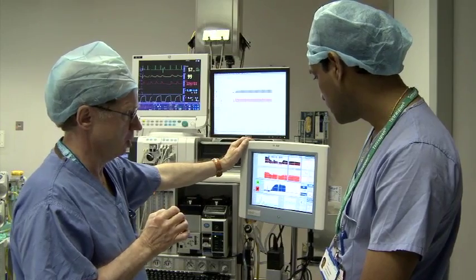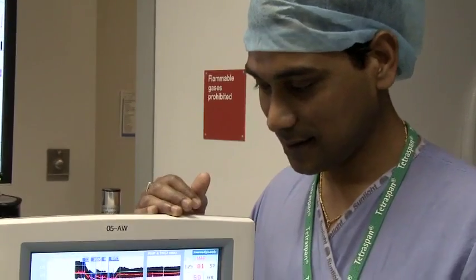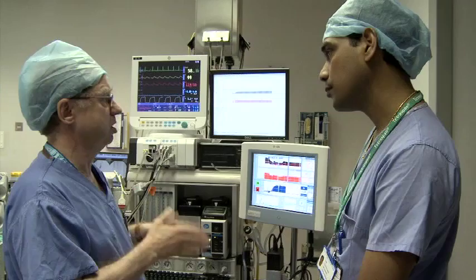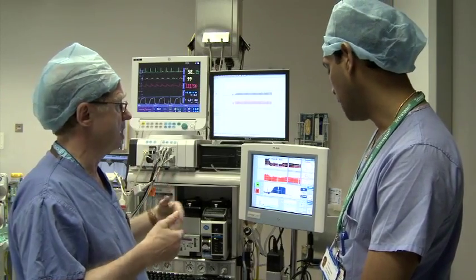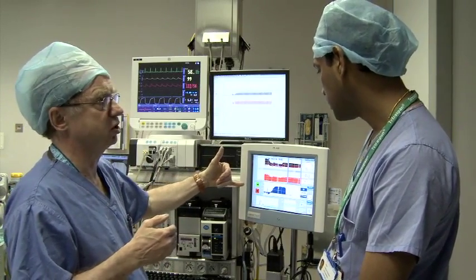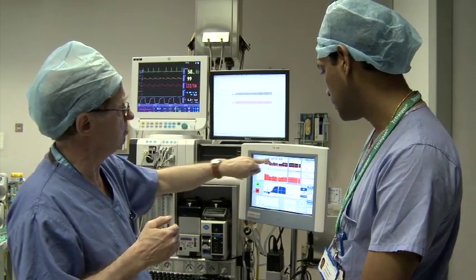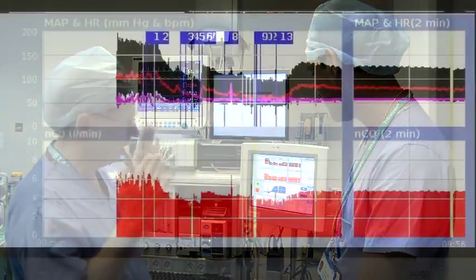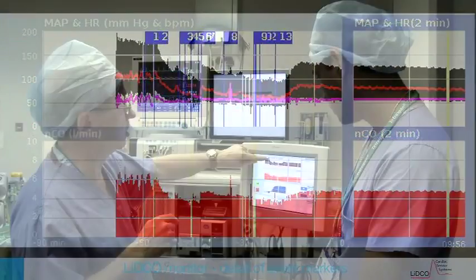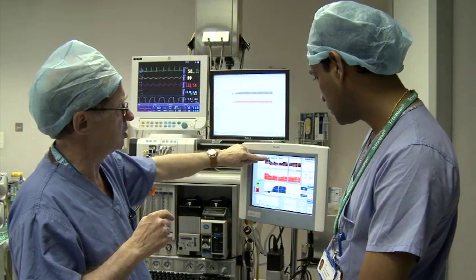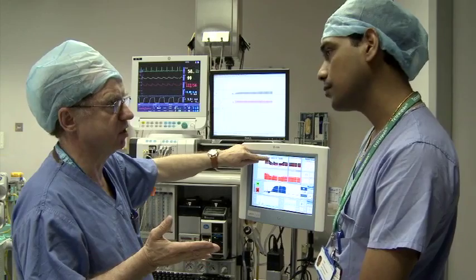The important thing about the LIDCO is calculating stroke volume from pulse power analysis. It captures the cardiac output of the patient preoperatively, pre-induction — his baseline status quo. What we're really looking for is change when we put him off to sleep. You can see these various event marks along the top: one indicates we're beginning to give remifentanil, and two is we're beginning to give propofol, which is the intravenous induction agent.